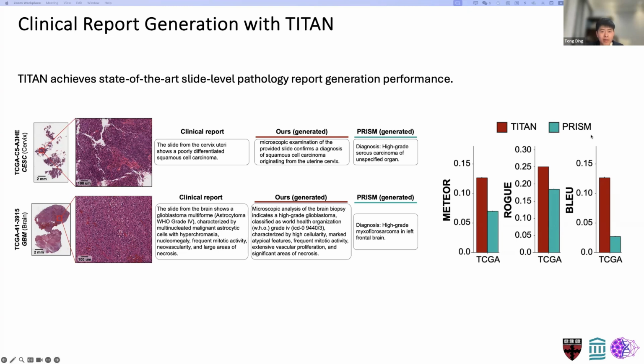And as a side note here, we will also make our processed TCGA slide level reports available. It was built on the previous efforts of OCR of the TCGA case level reports, and we further process it into slide level reports.